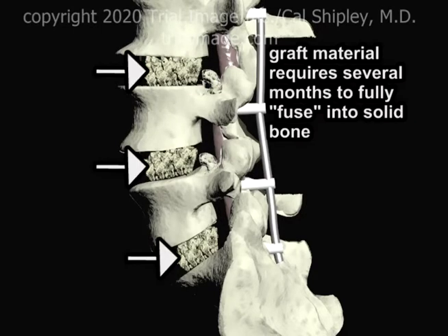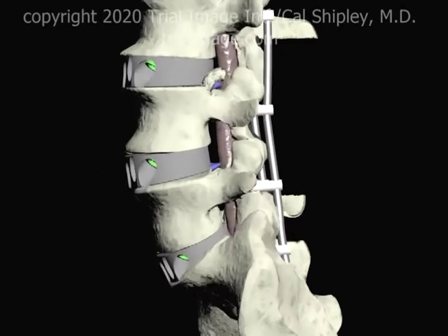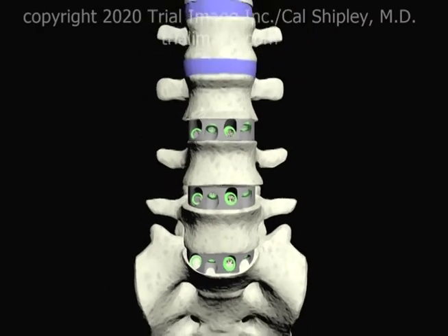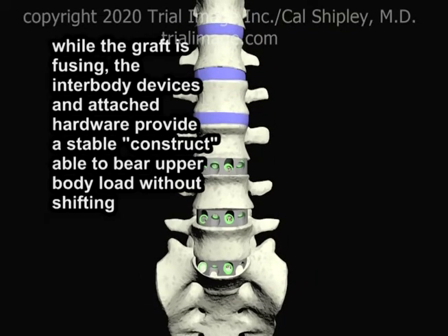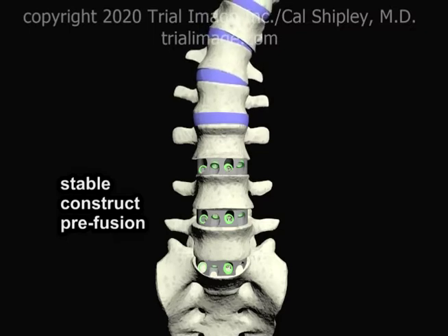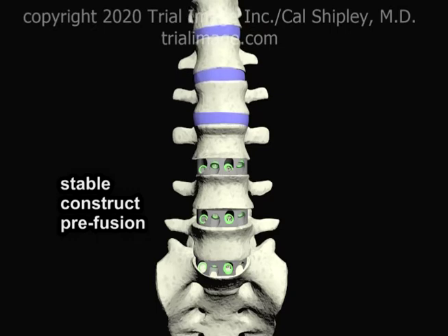The graft material placed into the disc spaces requires several months to fuse into solid bone. While the graft is fusing, the interbody devices and attached hardware provide a stable construct, able to bear upper body load without shifting. Lateral flexion of the spine, as well as anterior-posterior flexion and extension, are supported by the hardware while the graft material undergoes fusion.